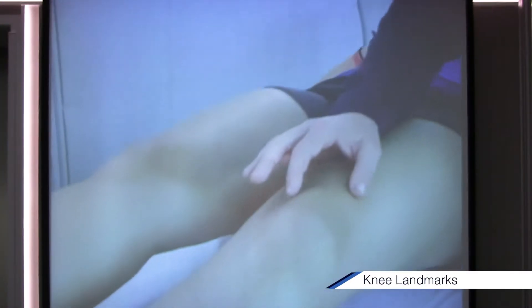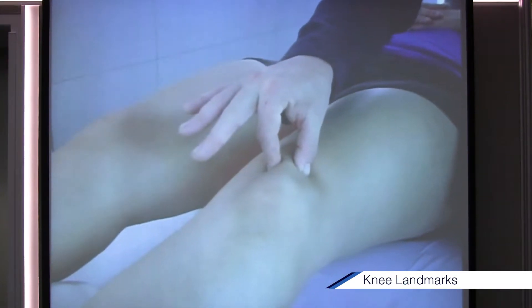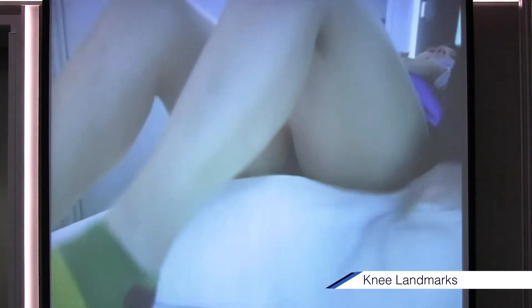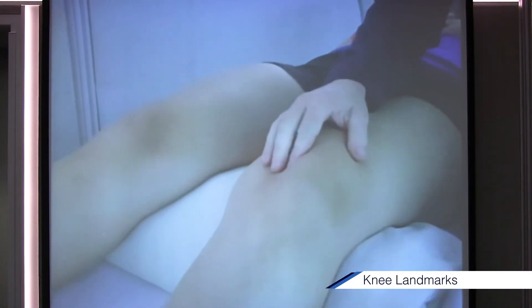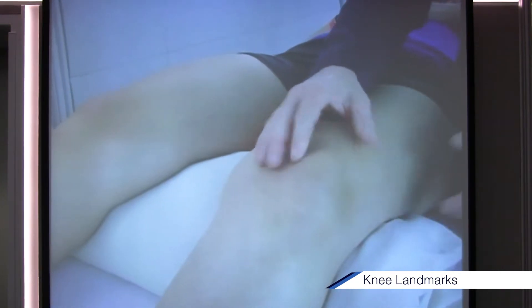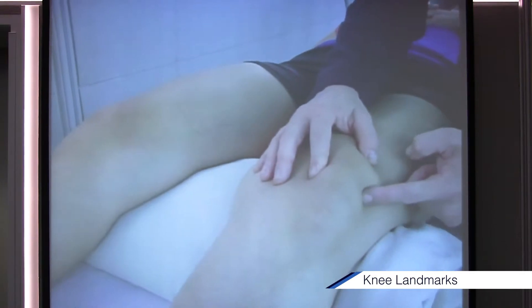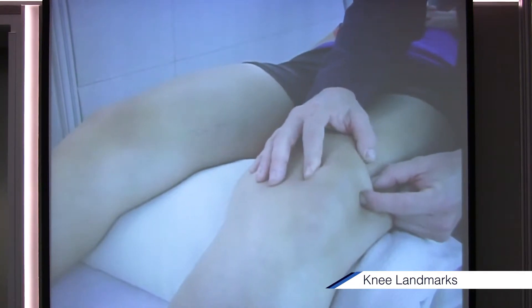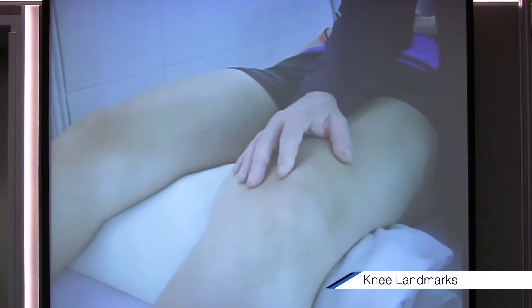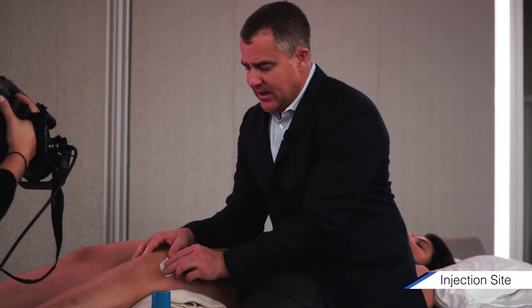The landmarks I'm going to use — I'm not actually going to inject you — are the top of the patella right here, and then the lateral border of the patella. Pick your legs up and put them down. I can get them to totally relax by sitting on a pillow or towel. When I push the kneecap over, you can see it goes up here — that means I have about two finger-breadths of space above the kneecap where I can safely do the injection.